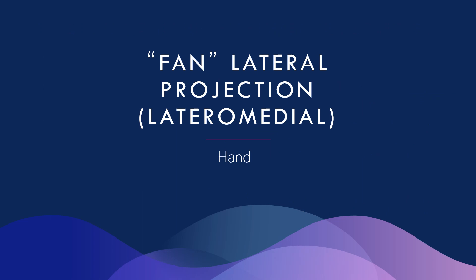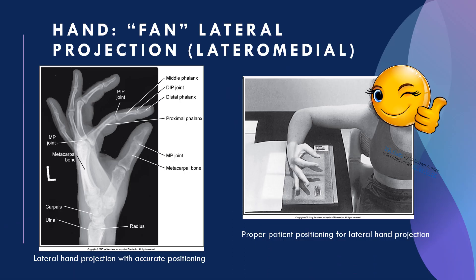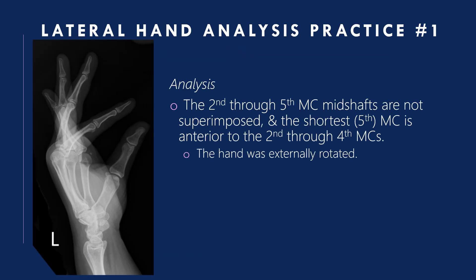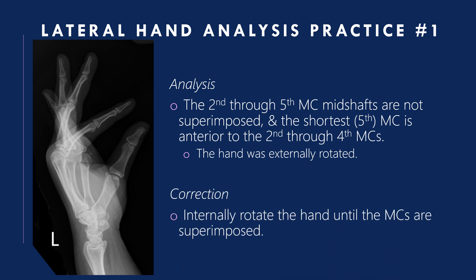Fan lateral projection — lateral-medial hand: here is an accurate positioning and projection of the lateral fan hand. Analysis practice one: the second through fifth metacarpal mid-shafts are not superimposed and the fifth metacarpal is anterior to the second through fourth. The hand was externally rotated. Correction: internally rotate the hand until the metacarpals are superimposed.